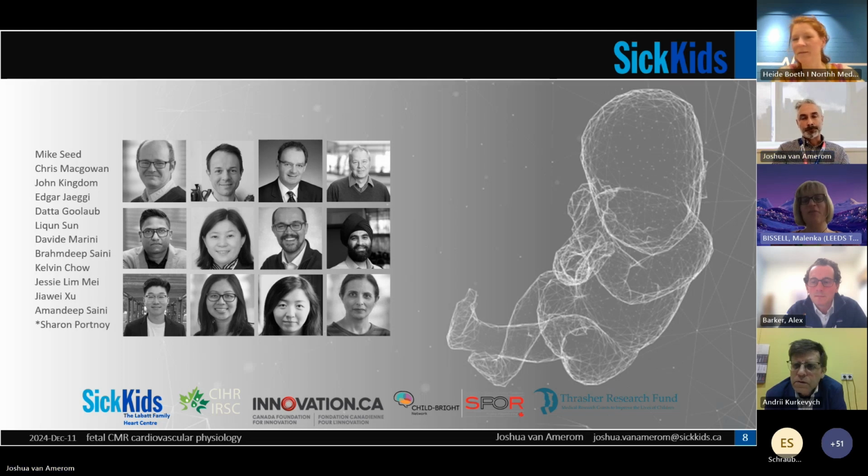And I think it's a bit of a leading question back to the previous topic, right? Because I generally think 2D flow is really hard. Is that really where we're going to be heading in the future, or are we just going to pack it in and go for 4D flow? Because then we don't need to worry where all these individual vessels are. We acquire the 4D flow and we'll figure it out afterwards once the fetus is off the scanner in 3D.